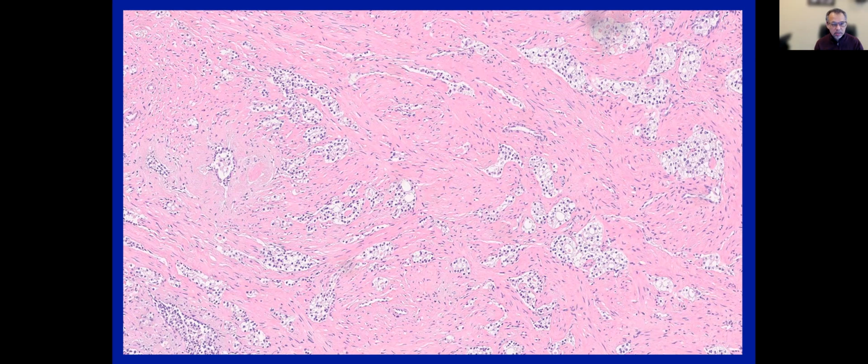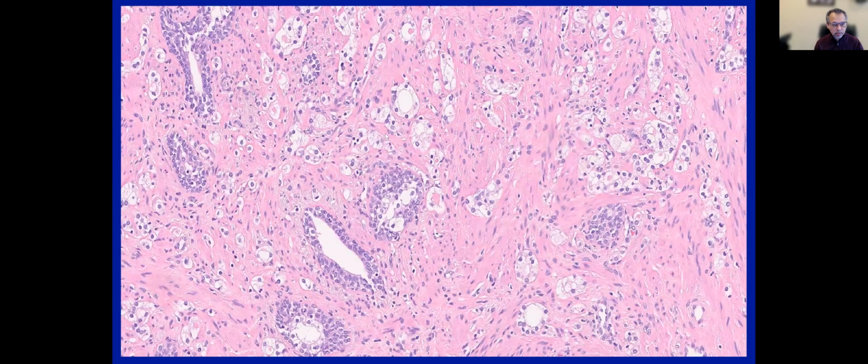And here is the highest magnification image, clearly a very infiltrative process. And again, notice the very poorly differentiated nature of these cells. There is one thing that you can also appreciate, that nuclei seem to be very pyknotic. You don't see very prominent nucleoli amongst them. And again, notice the clear cell change, atrophic nature of these benign glands.